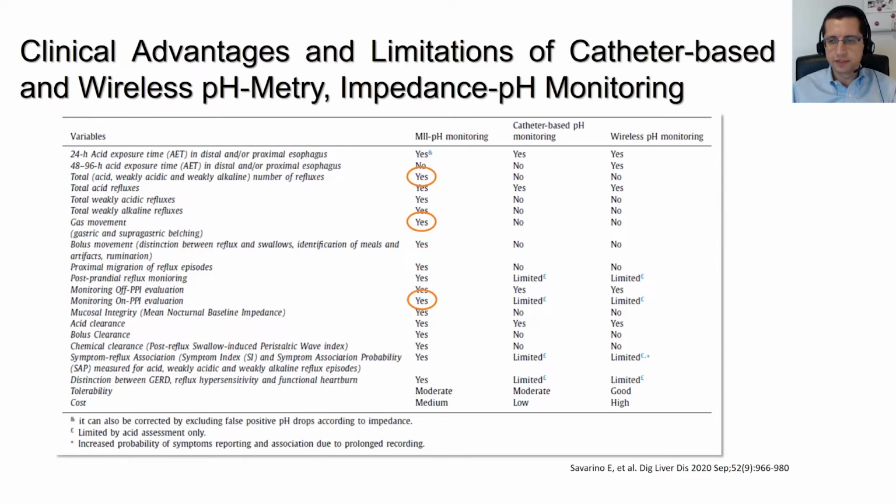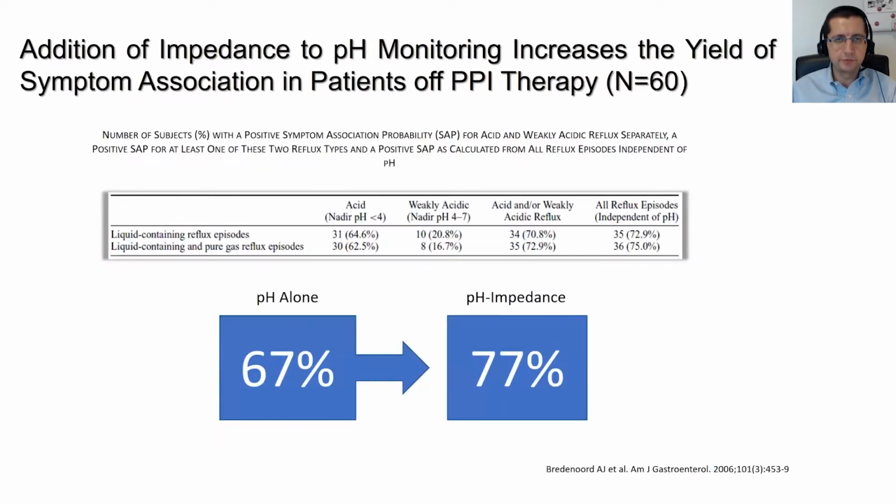This, of course, helps in improving our ability to correlate symptoms to reflux episodes because of the ability of detecting also non-acid reflux episodes.